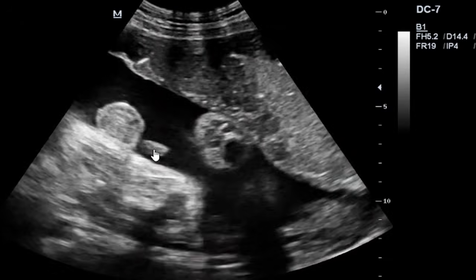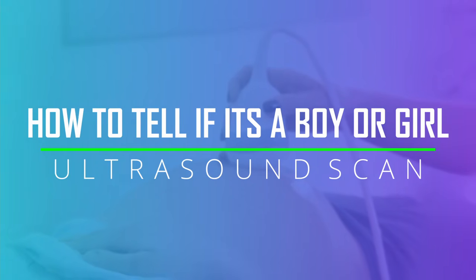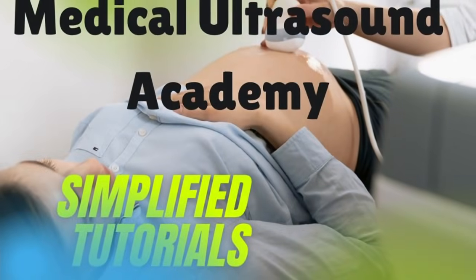Gender of the fetus. I'm going to briefly explain in this tutorial how we determine the fetal sex using medical ultrasound.